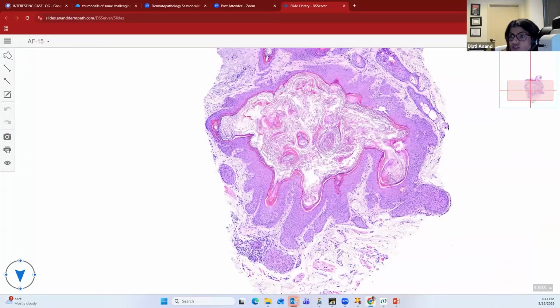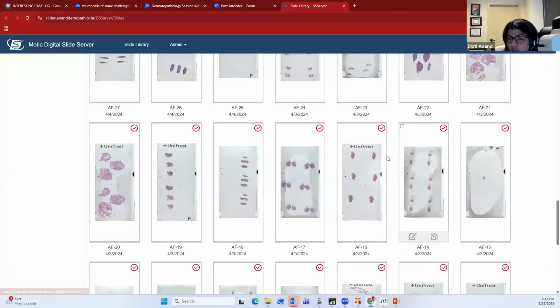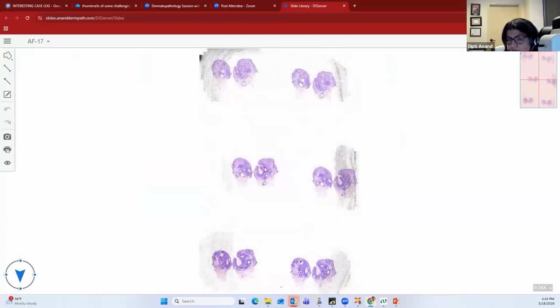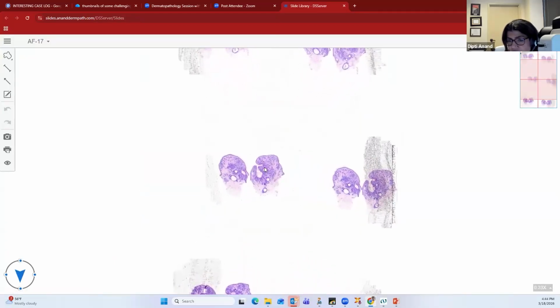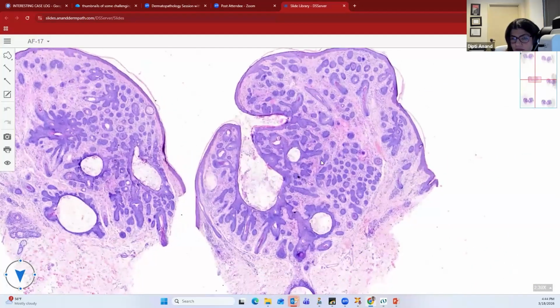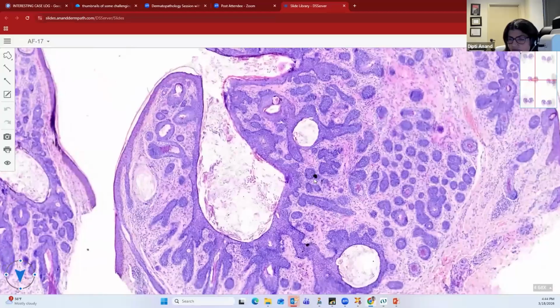The classic location of this lesion is on the upper lip. One step beyond it is going to be the trichofolliculoma. The trichofolliculoma is classically referred to as mama and baby appearance. It's a very classic appearing tumor. If you've seen it, you'll always remember it. It has a central cystic invagination, and radiating from the central cyst are all these immature hair follicles. So you can see these nice immature hair follicles radiating from the central cyst.